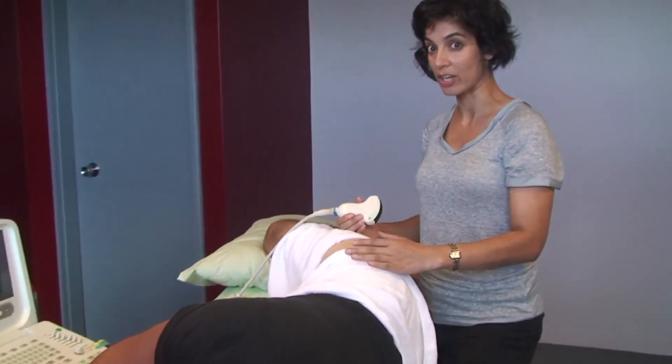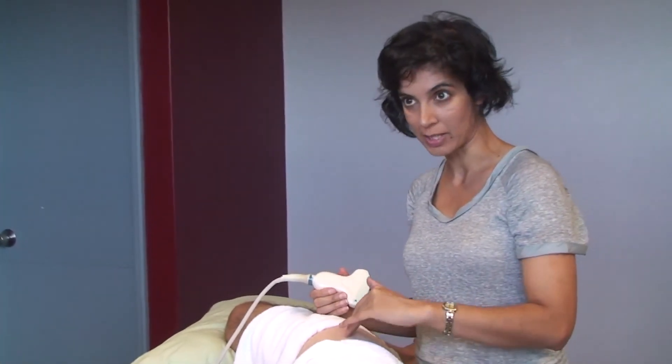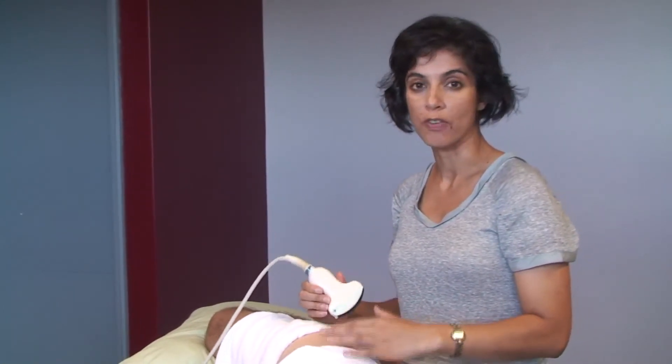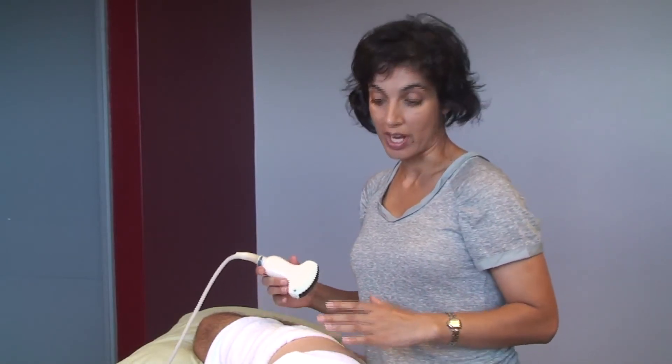Quadratus femoris is an external rotator of the hip, and the glute minimus is an internal rotator. When there is hip pain, these muscles are often very weak and need to be rehabilitated. We want to rehabilitate them to come on together in a co-contraction — they're acting as a rotator cuff around the femoral head. Using the machine, we've learned the cues to enable your client to contract those two muscles together and incorporate that into their home functional exercise program.